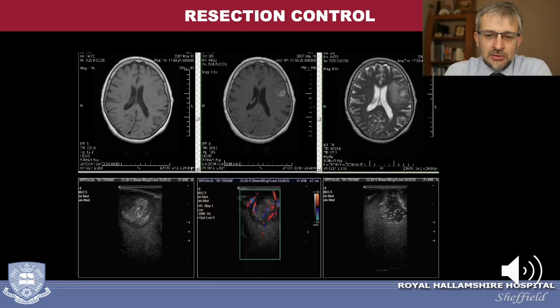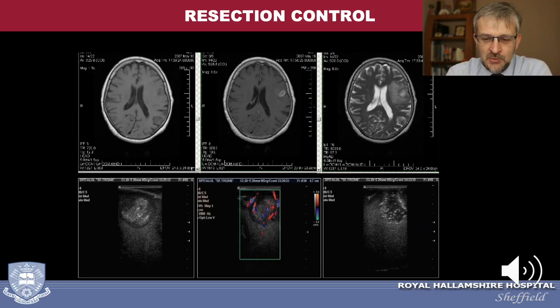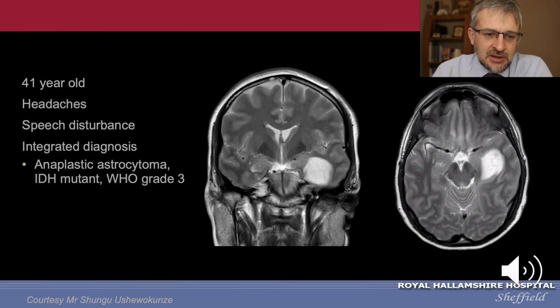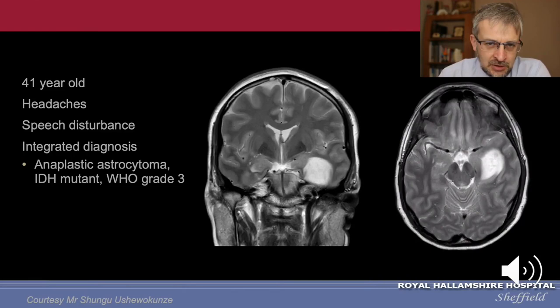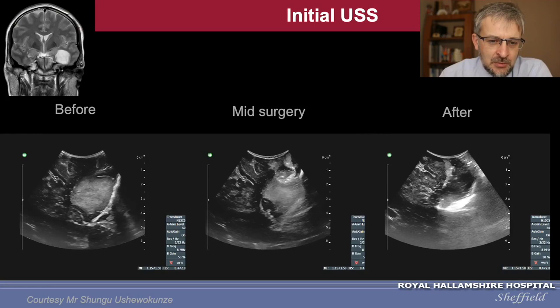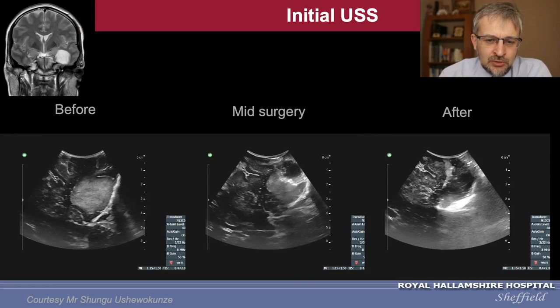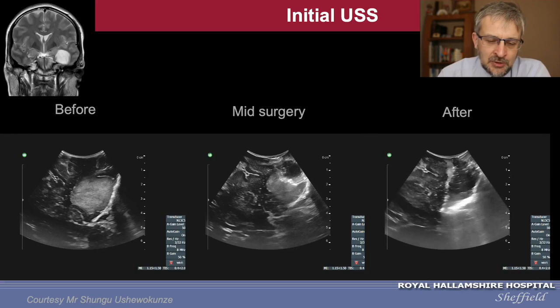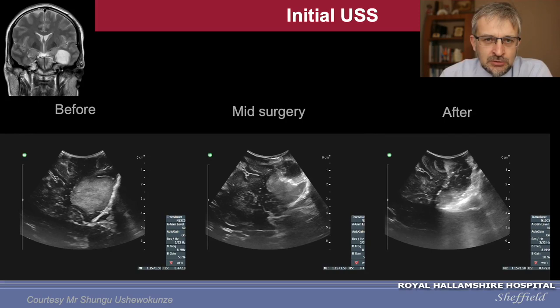Once you learn to identify and define a lesion, you can explore additional benefits. For tumors, you are not just seeing the tumor — you can also estimate the degree of resection: whether you achieved gross total removal or if there is residual tumor. This is a patient with anaplastic astrocytoma IDH-mutant WHO grade 3. The ultrasound shows before resection, partial debulking with the cavity created, and finally complete tumor removal confirmed on postoperative MRI with gross total resection achieved.